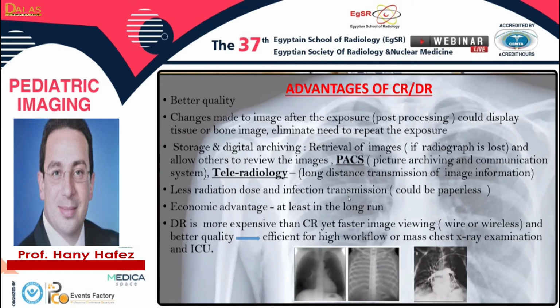The advantages of CR and DR: better quality, changes could be made to the image after the exposure, storage and digital archiving, so we can use PACS and teleradiology, less radiation dose, and also better infection control. Economic advantage, especially in the long run.